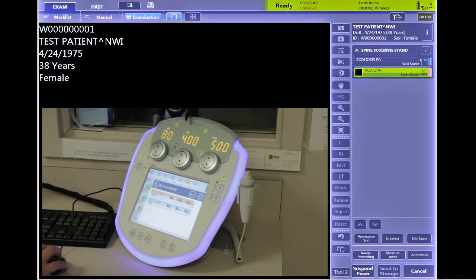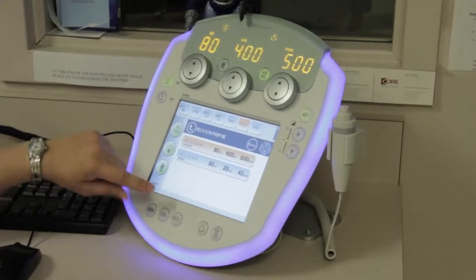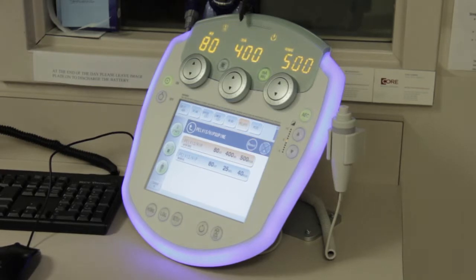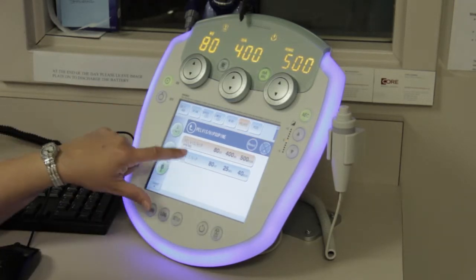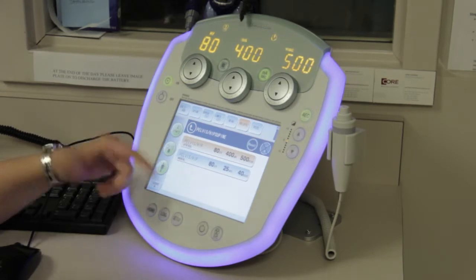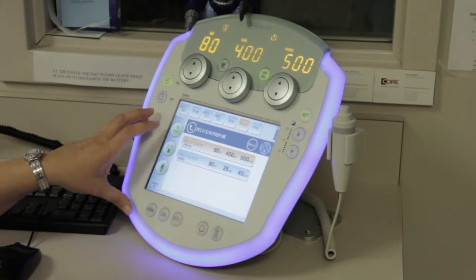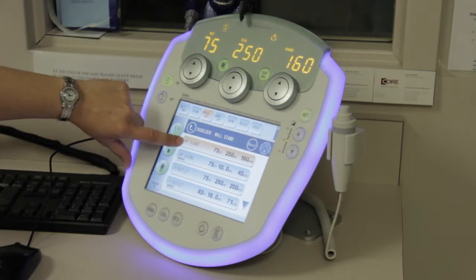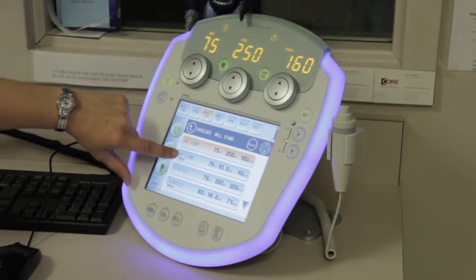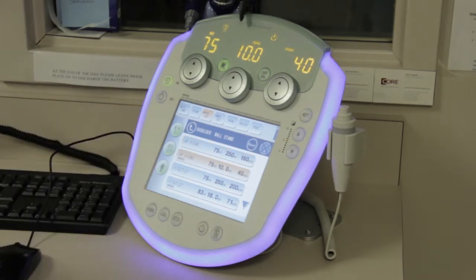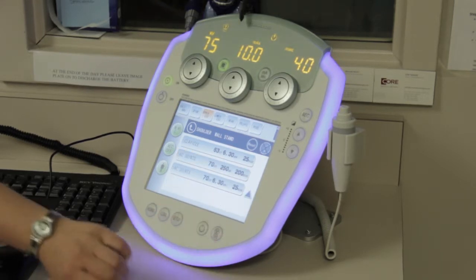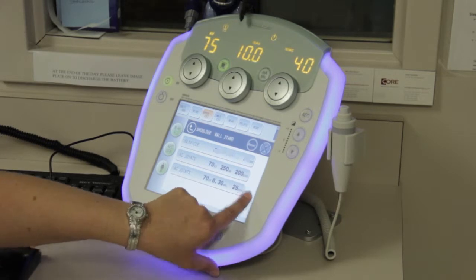We've set our patient up on the Canon screen for an AP pelvis on the table. On the generator panel, the protocol in orange is the one selected — that's what I'm going to get when I shoot. Anything in blue is another choice but it is not active. I will often have a photo-timed technique and right under it a manually-timed technique. You can always switch to that manual technique. Anytime you see a down arrow on the side, you have another page behind that page, and the up arrow takes you back.